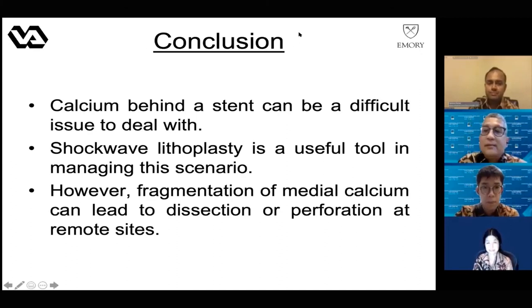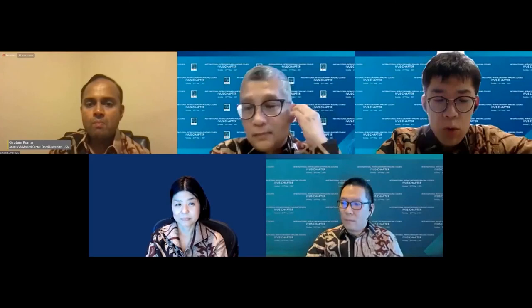Dr. Suki, may I ask you about this kind of lesion? Do you use the rotablator to correct this underexpansion in this situation? Yes, sometimes we do. Stent ablation is one of the options for the unexpanded stent. We do the ablation with a very high rotational speed, and it takes a longer time than conventional ablation, I think. It's a good indication, I think.